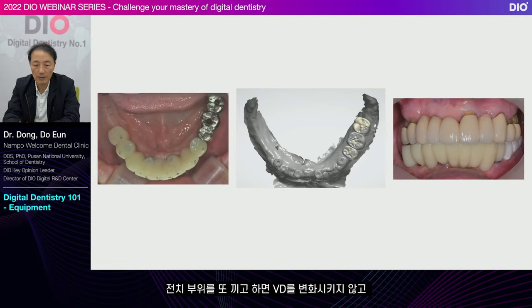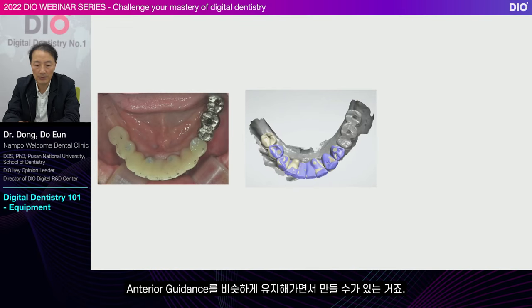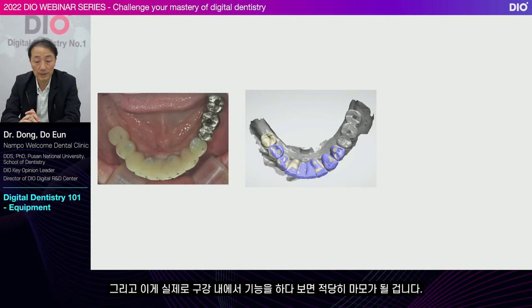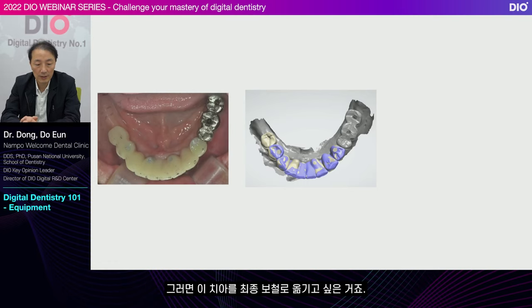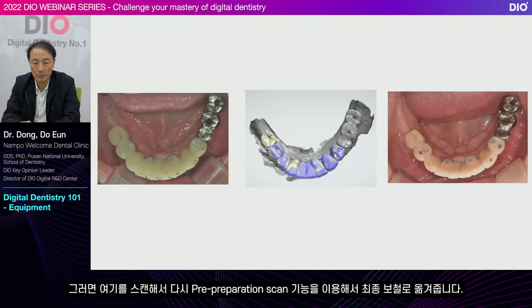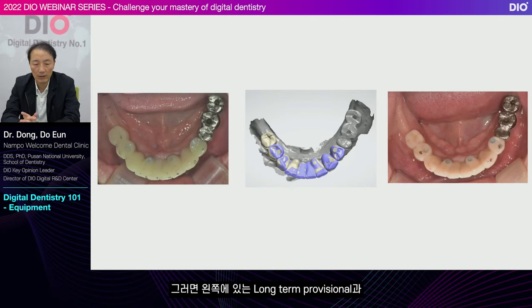If you place the anterior part, then you can make it without changing the VD and maintaining a similar anterior guidance. And it can't fit perfectly inside the mouth, and there will be some wear as it functions in the mouth. Then you want to move this tooth to the final prosthesis. Then you can scan here and use the pre-preparation scan function to move it to the final prosthesis. Then, the long-term provisional on the left and the zirconia prosthesis on the right will be reproduced in a similar form.